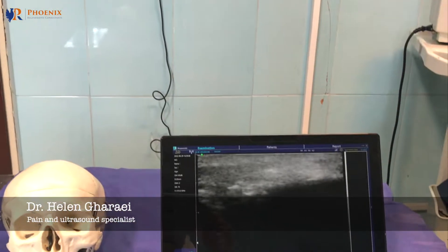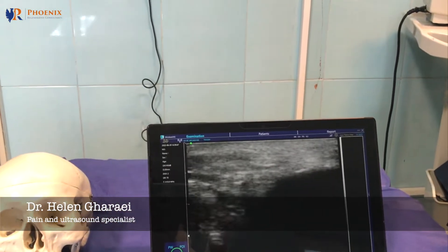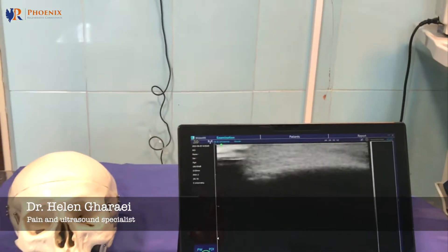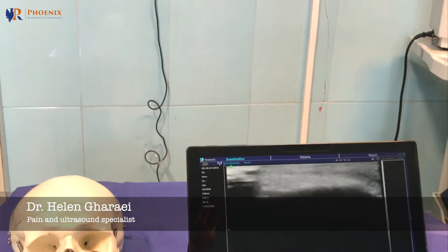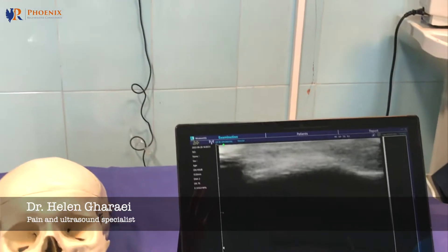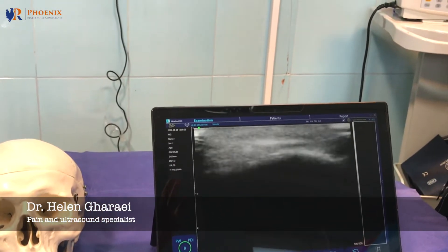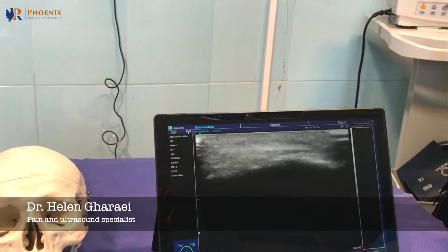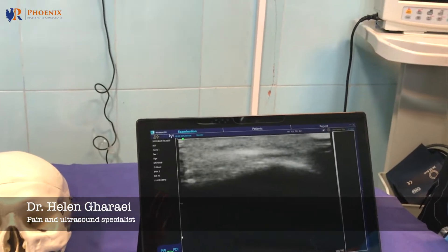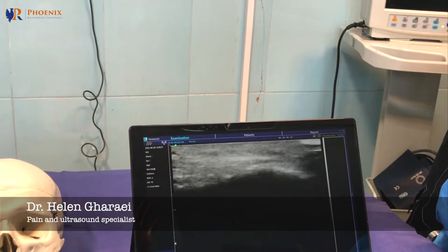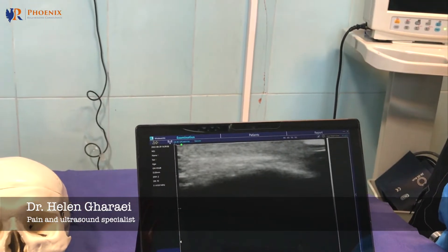Then move your probe more medially to see the supraorbital notch. Here you can see the supraorbital notch and the pulse of the artery.